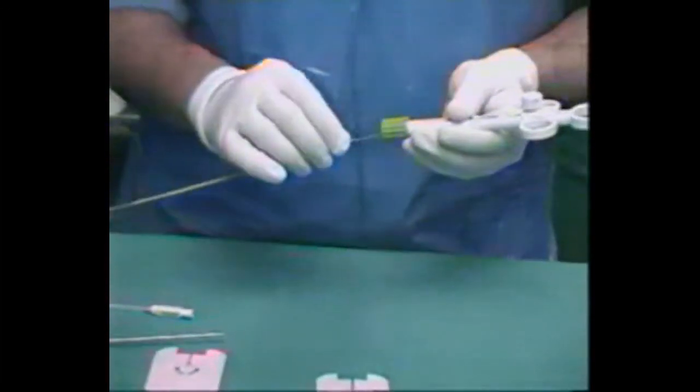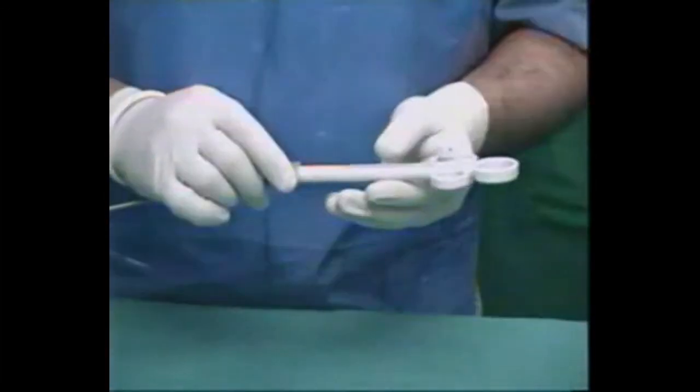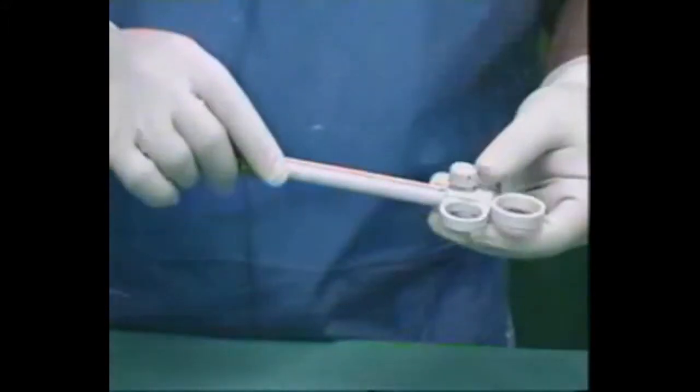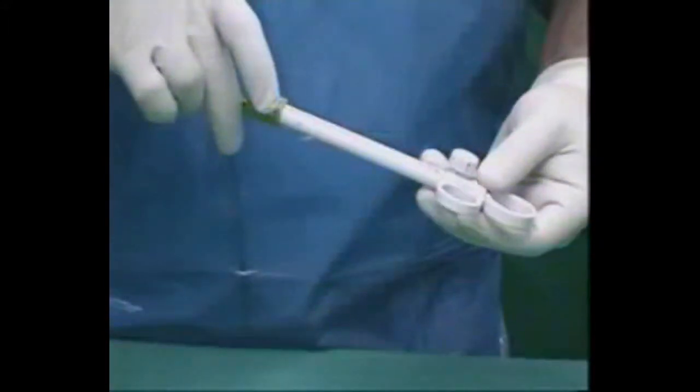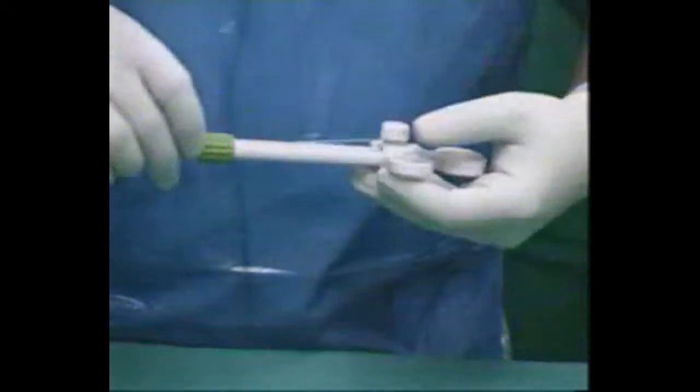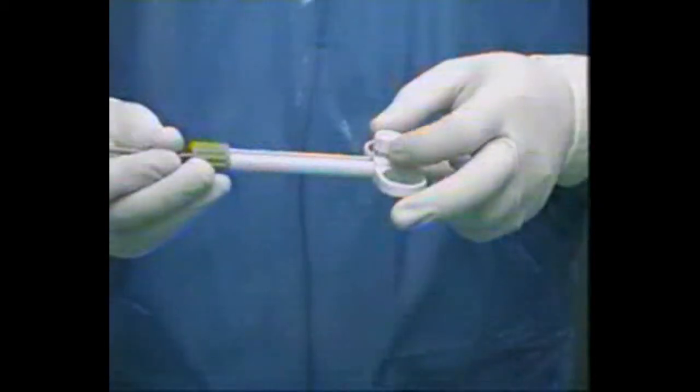The endo loop assembly has a plastic handle to which a metal cannula is fixed. The metal cannula has a metal needle with a groove at its distal end.